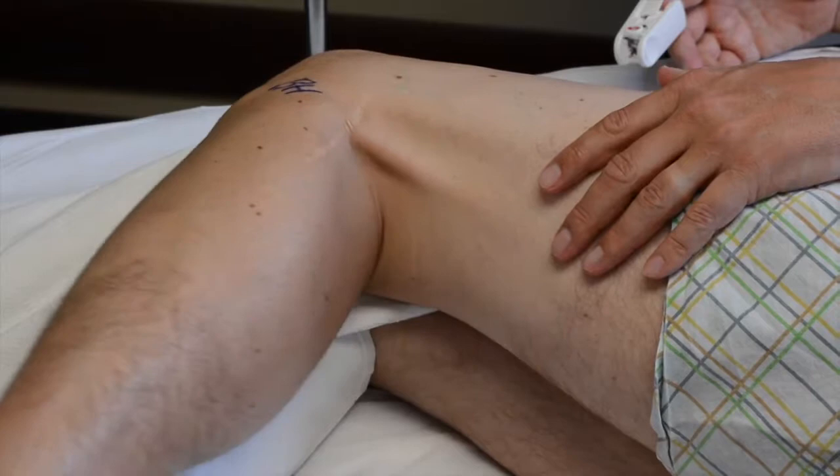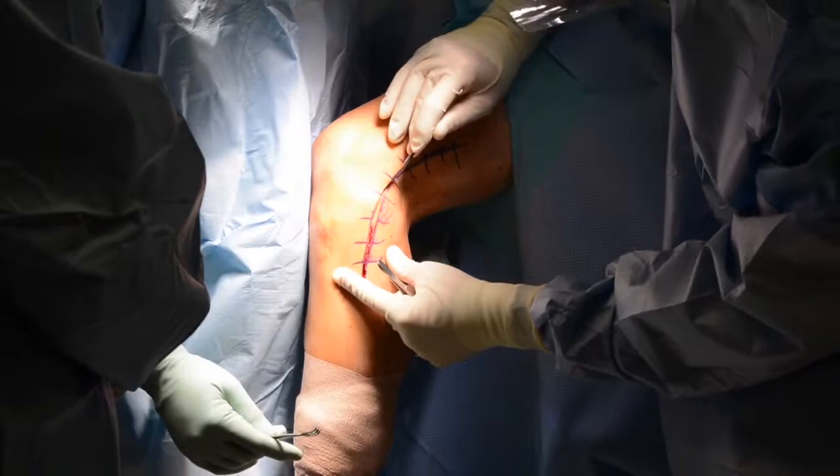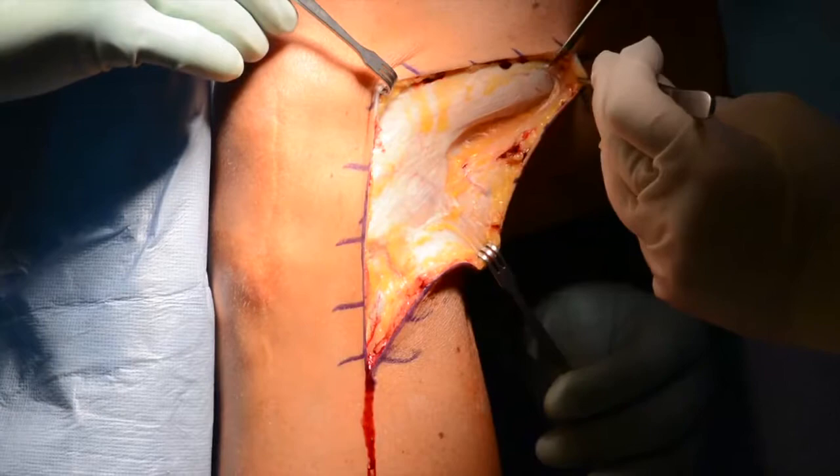Following proper patient positioning and tourniquet placement, a standard lateral hockey stick incision is made. Dissection is conducted down to the superficial layer of the iliotibial band over the long and short heads of the biceps femoris.